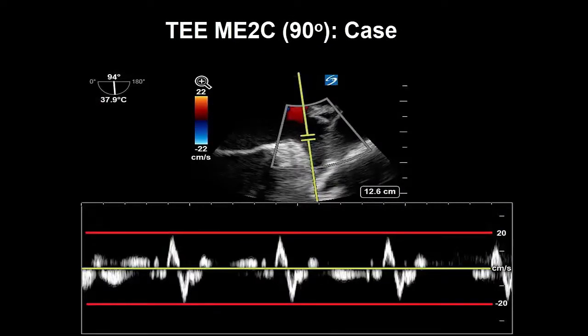And finally, we have a pulse wave Doppler spectral signal from the left atrial appendage of our patient, and we see that the flows do not even meet a cutoff of 20 centimeters per second. So this is all non-reassuring and suggestive of a low flow state with low flows of less than 20 centimeters per second, ongoing smoke and spontaneous echo contrast, and also a visualization of an active clot in the left atrial appendage, and ongoing nidus for further formation.